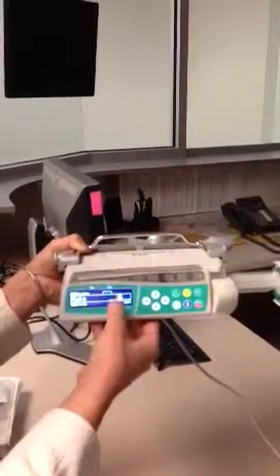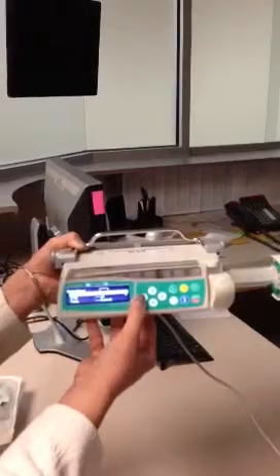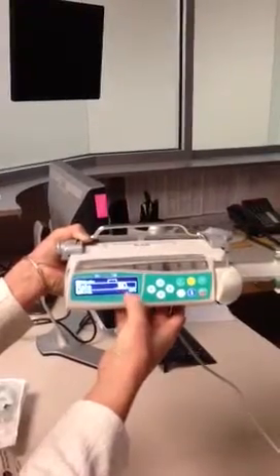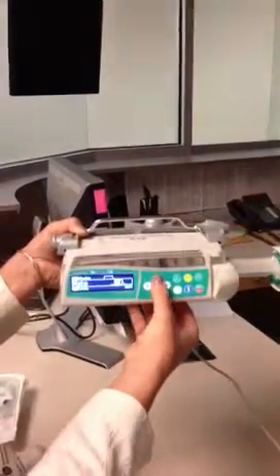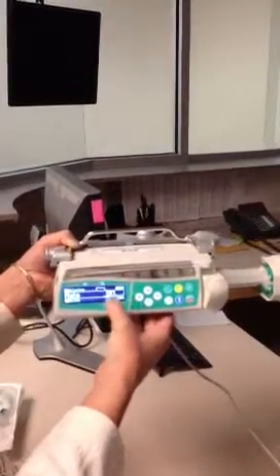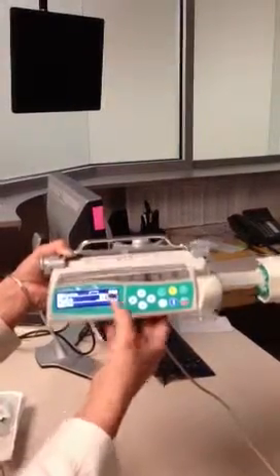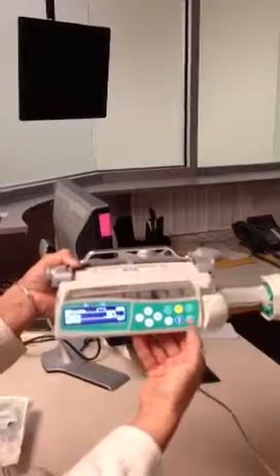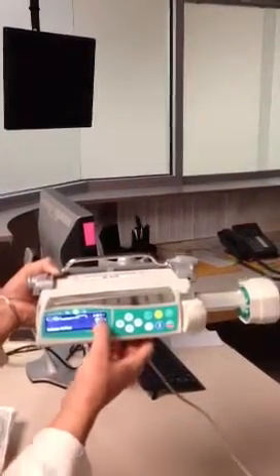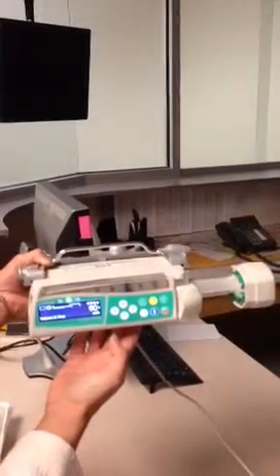You have your ones column and your tens column. Left arrow over to the tens column because we're going to enter in 60 mLs per hour. Up arrow to enter a 6 in the tens column — now we've entered 60 mLs per hour. We know we can start because there's a start icon at the right-hand side of the screen. I can start my infusion — I'm running 60 mLs per hour. I know I'm running because I've got arrows at the right-hand side of the screen and a green light at the top of the pump.